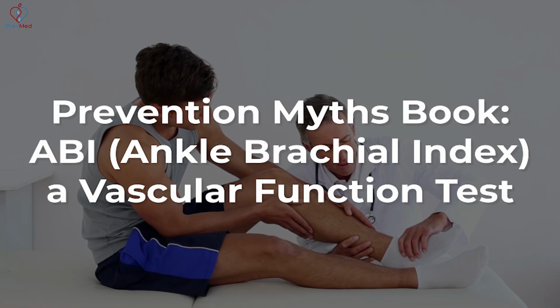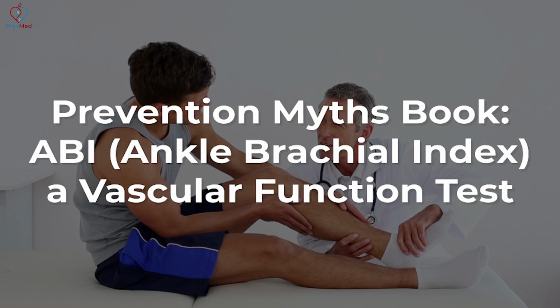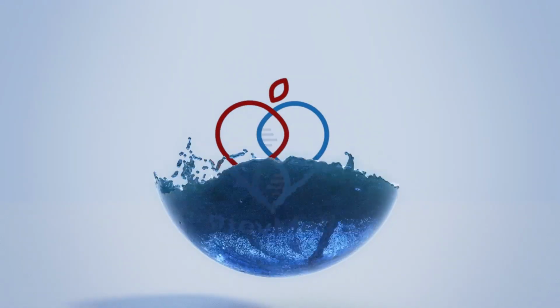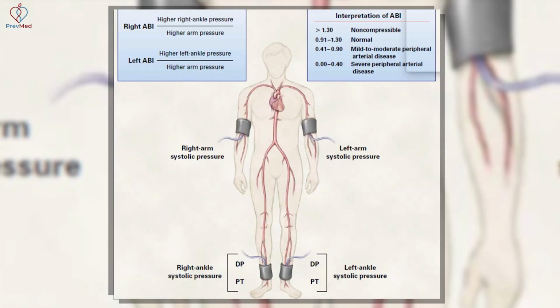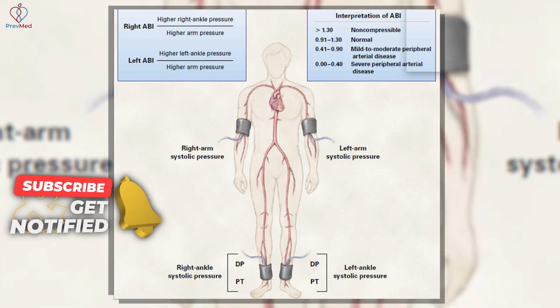So the content today is ABI, ankle brachial index. It is a type of vascular function test. If you'll look in here, you'll see, yes, we're talking about actually getting blood pressure from an ankle. Why do you want to do that?